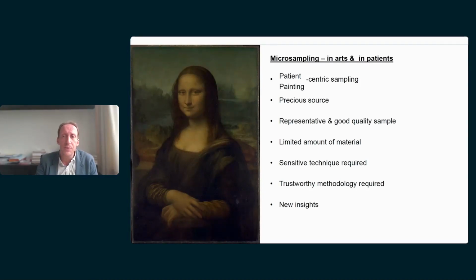For instance, think about the presence of a micronutrient in a population, for instance, in remote Africa, or about the extent to which certain population has been exposed to forever chemicals, like, for instance, PFAS in communities near industrial production sites. Or think about, for instance, fluctuation of drug levels if you consider home sampling. And I'm sure the audience can come up with many new scenarios where also microsampling may lead to new insights.